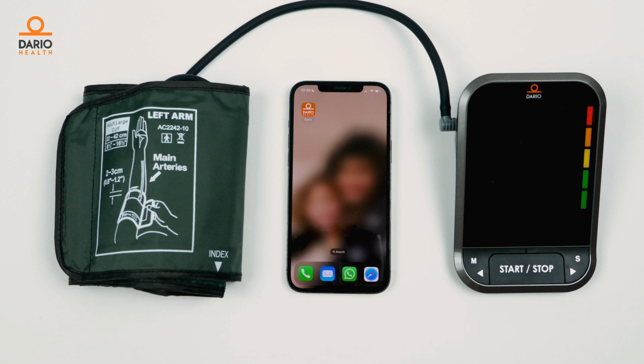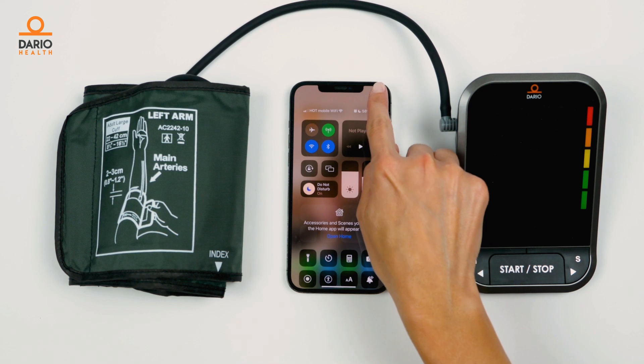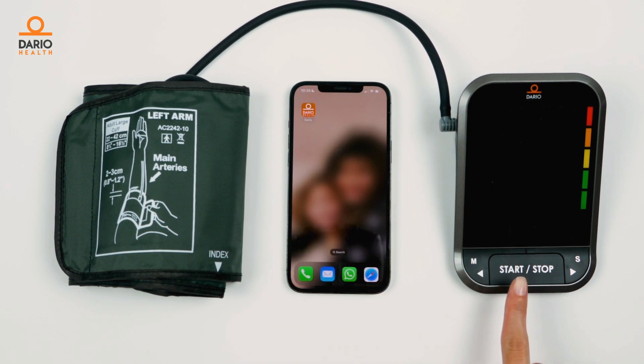Here's how to do it. First, make sure your cell phone has Bluetooth turned on. Your Dario blood pressure monitor should be off.